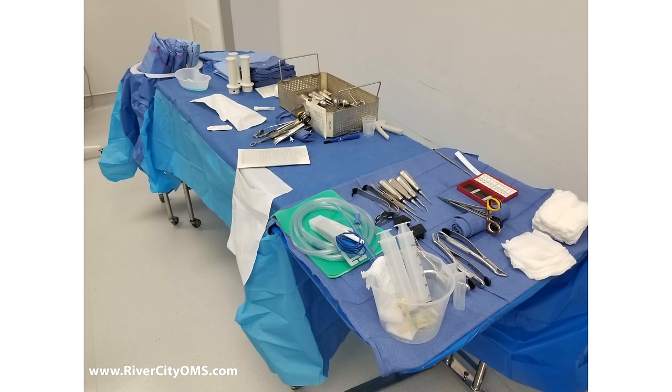Here's another towel roll with some more what we call ringed instruments because they have rings on the handles up here. This is a Fraser tip suction. These are some more hemostats. There's going to be a couple of pairs of scissors in here. This is a sponge holder, so you can put one of these pieces of gauze into that and then reach down into a hole to apply the gauze.